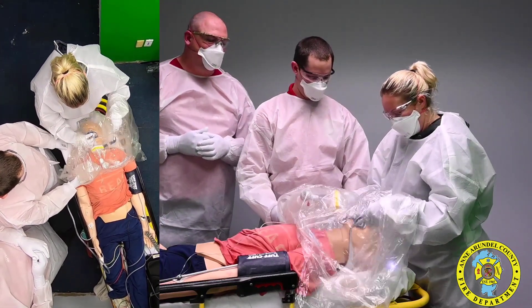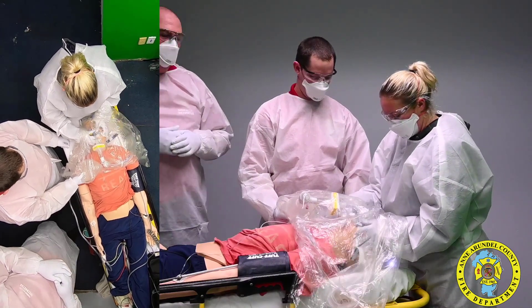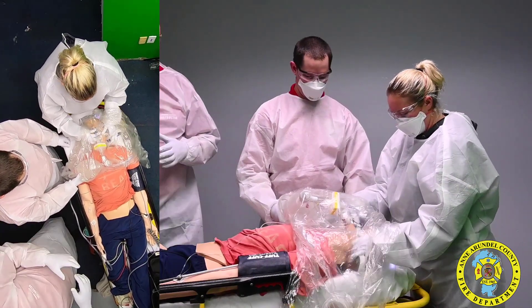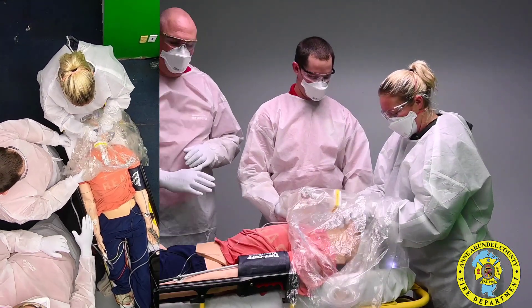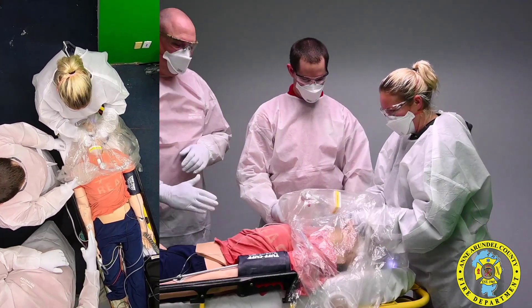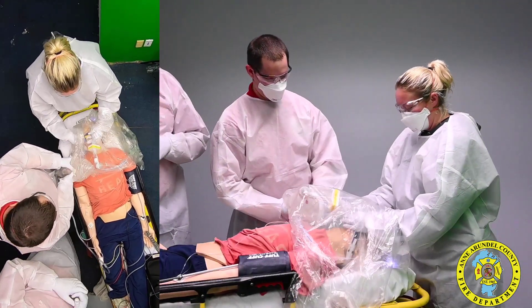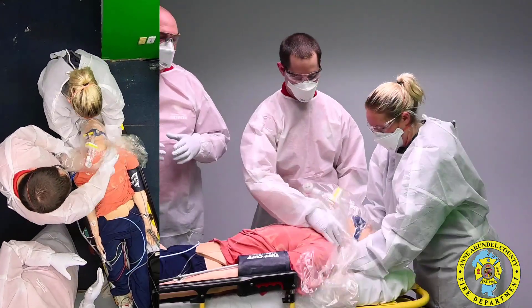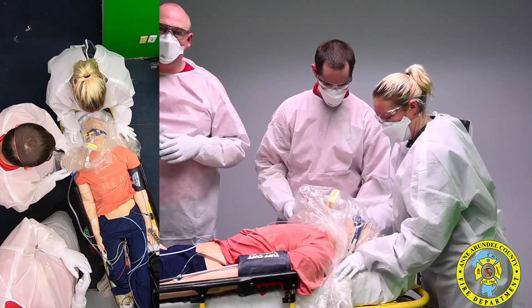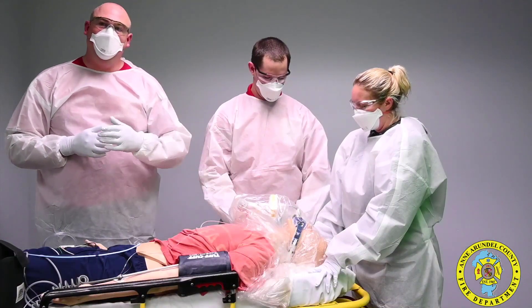Once that device is in place and the tube is secured, we are going to move into packaging the patient for transport. The only thing we want to make sure you have in place is suction — run the suction along the side of the patient and make sure a suction catheter is inside the plastic. If the patient starts to vomit during transport, we want to get that situation under control as fast as possible. The patient is going to be ventilated like this all the way to the hospital.